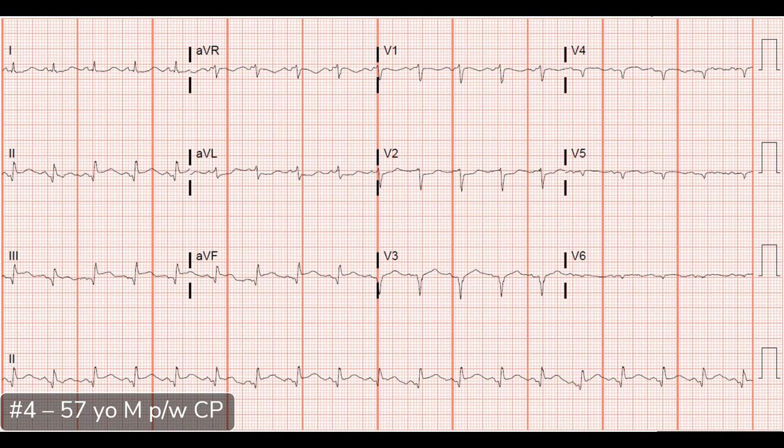I see reciprocal depressions in the high lateral leads 1 and AVL, and maybe starting to creep into the right precordial leads, particularly V2. Regarding the ST segments in 2, 3, and AVF — if you look at the degree of ST elevation, maybe lead 3 has 1 millimeter, but the rest are sub-millimeter. Some may say this doesn't quite meet criteria for a STEMI.